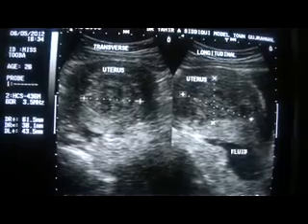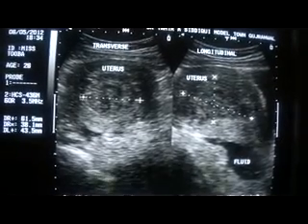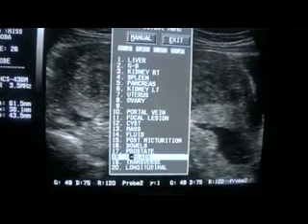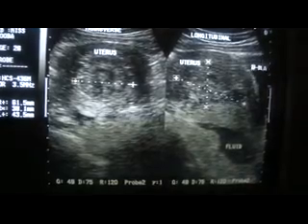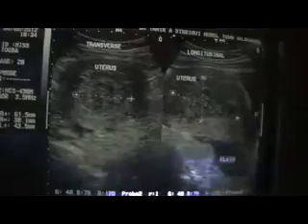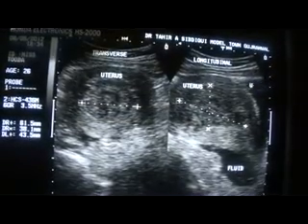So this is the fluid with echoes in the pelvic cavity. Now this fluid in transverse section, when I maneuver the probe 90 degrees and the uterus becomes longitudinal, you see that it is continuous with a pocket.